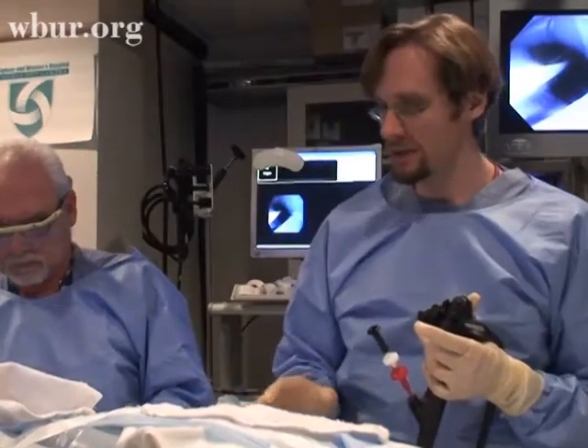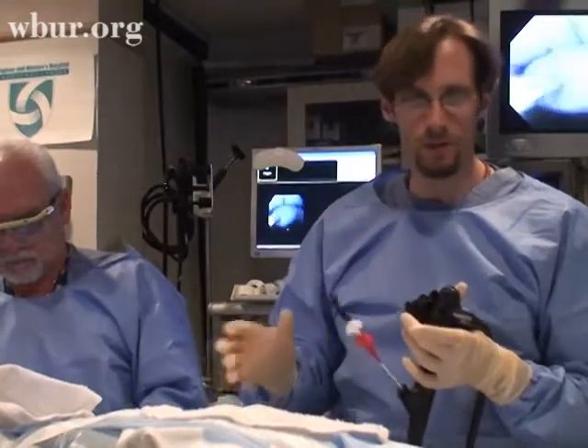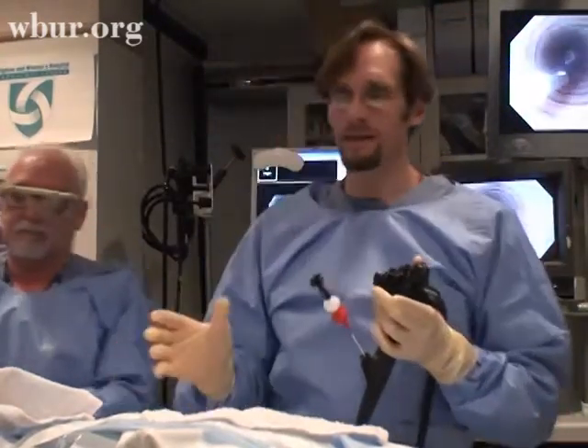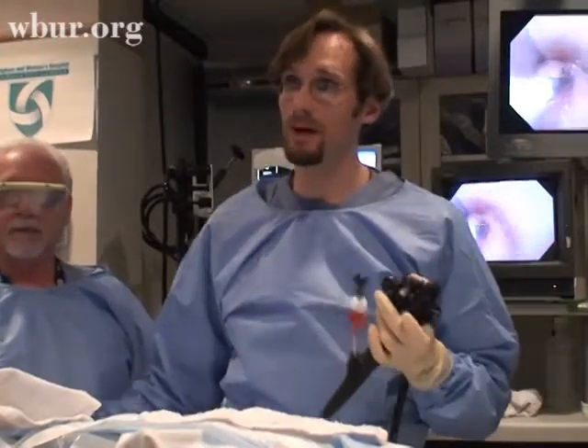When they do this procedure surgically, they create an incision in the abdomen — one large incision or multiple small incisions. They go in and have to dissect all the tissue out around the stomach, which can be a very time-consuming process, and they can run into bleeding and other problems.